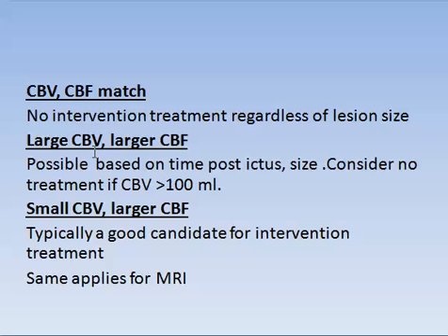Large cerebral blood volume but larger cerebral blood flow. This is possible based on the time post-ictus, post-insult, and the size.